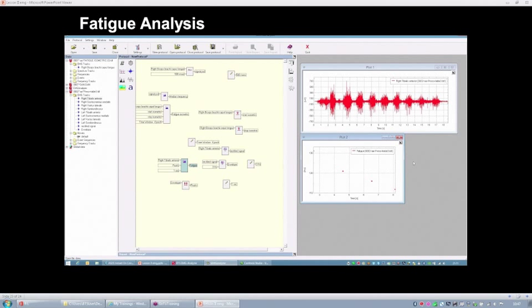During these 2 lessons, you have learned about the main algorithms that are commonly used in EMG applications. So now you should be able to use them within our EMGAnalyzer application, and I think that you can start to develop your own protocol.